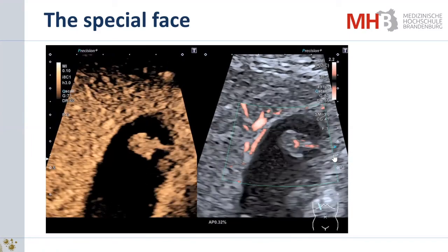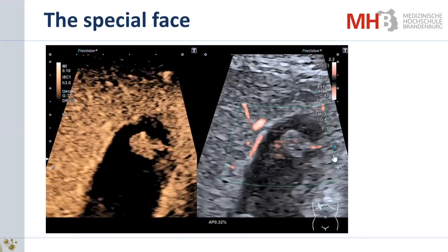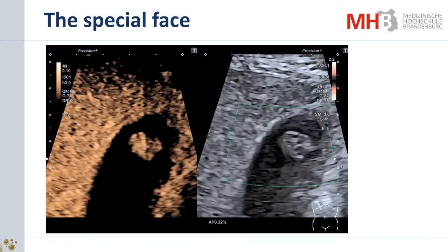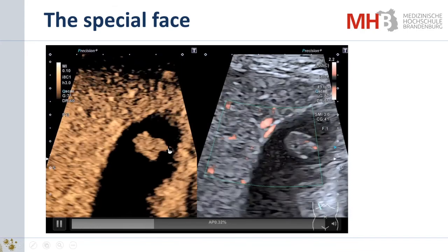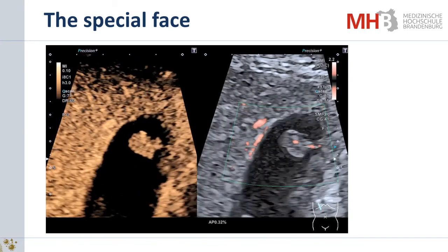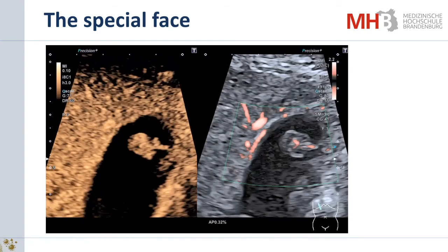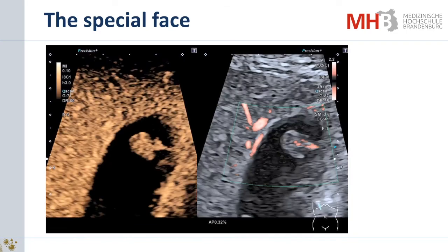And there's a lot of variety of differential diagnosis for this polyp. It may be a large cholesterol polyp. One argument is a very small stalk, but it could also be an adenoma, and there are some other types of polyps which have small cystic lesions, and I wait for the pathology report after surgery and will report again if you want.